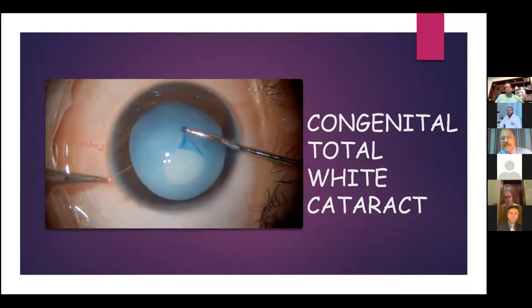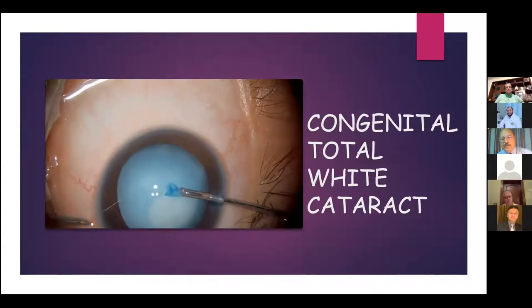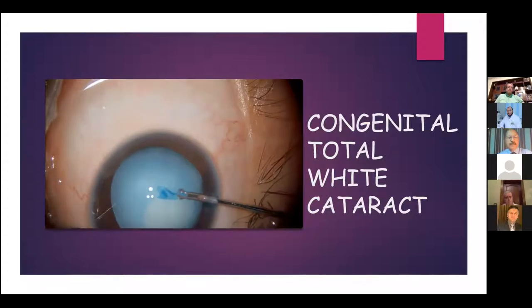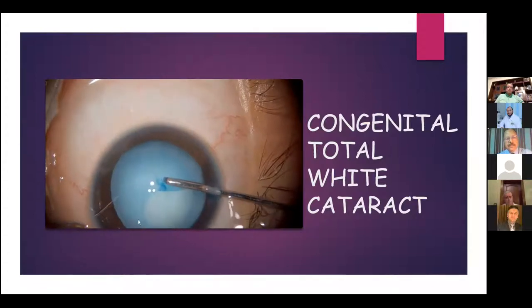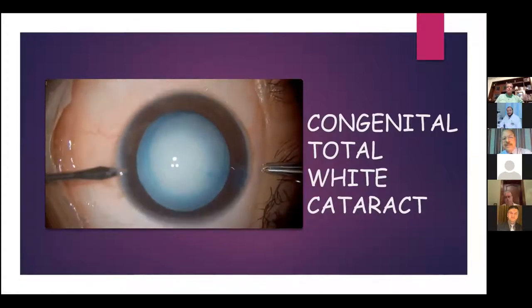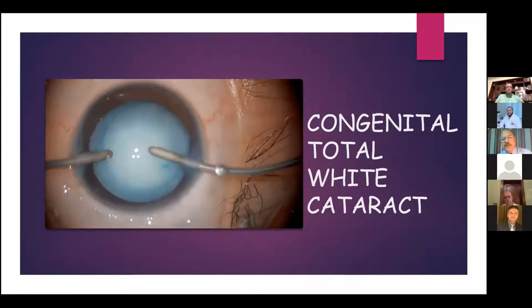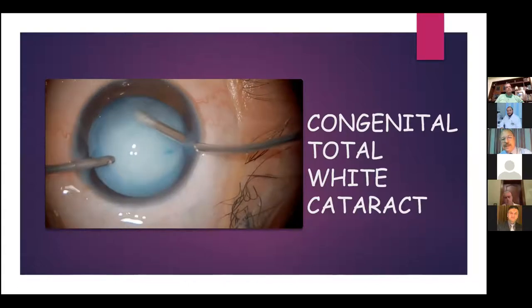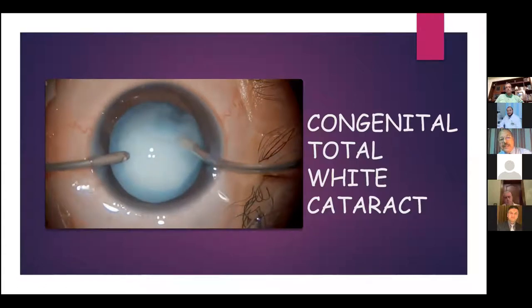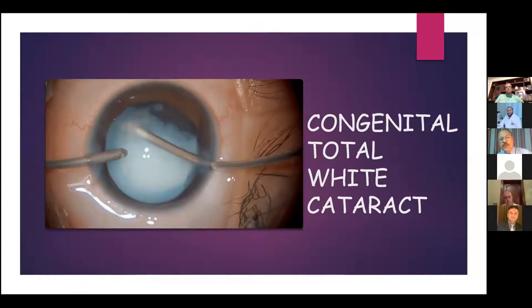And now tearing of the anterior capsule after cystotome using the micro scissor. Using the micro rexis forceps right now. And after completing the rexis, I created the side port on the other side, and I will use the bimanual irrigation aspiration to reduce lenticular pressure. And I will keep the central nuclear area as a scaffold to keep the posterior capsule.